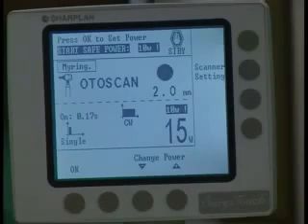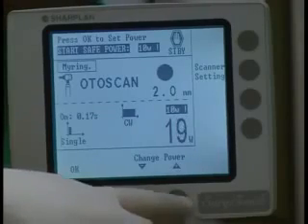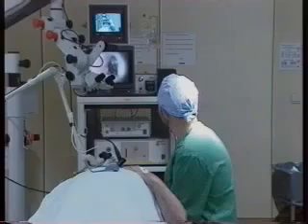The recommended power is 10 watts for a serous otitis, 15 watts for a mucous otitis, and 20 watts for a glue ear. In general, the laser beam is absorbed by the fluid in the middle ear. If too low a power is used, the laser beam is delivered to the same place.